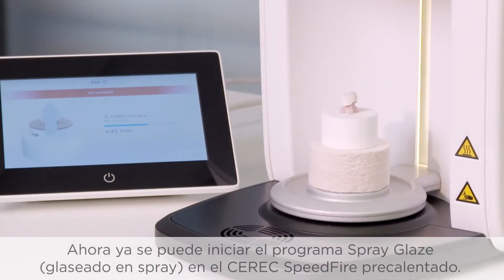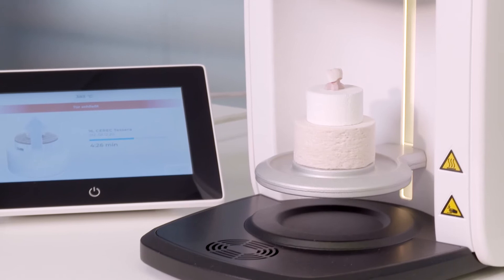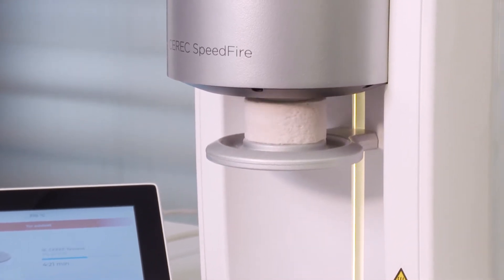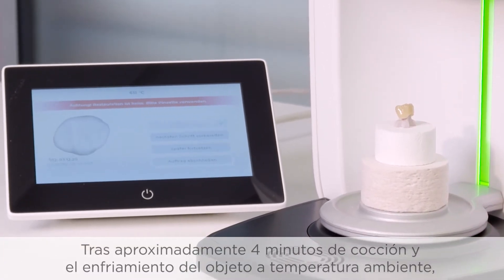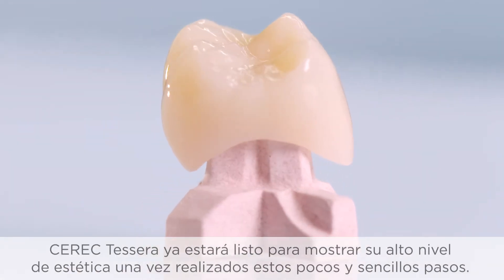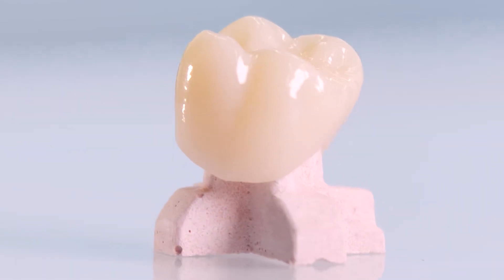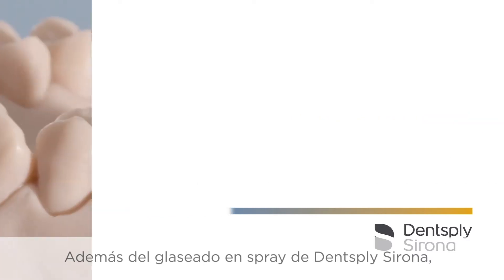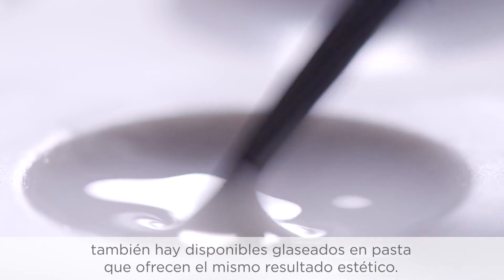The spray glaze program can now be started in the preheated Seric Speedfire. After approximately four minutes of firing time and cooling of the object to room temperature, Seric Tessera is already demonstrating its highly aesthetic properties after these few and simple steps. In addition to Dentsply Sirona spray glaze, glazes in paste form are also available for the same aesthetic results.